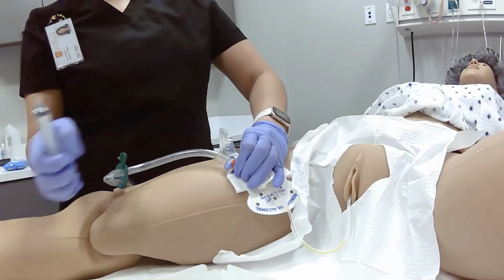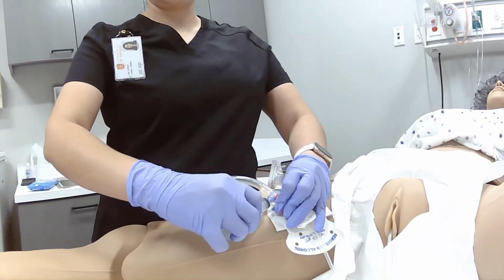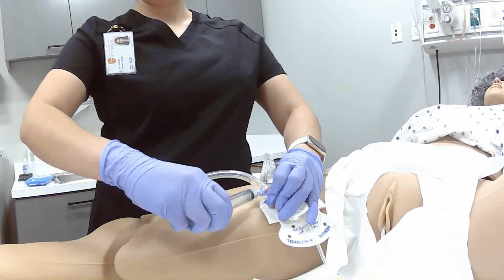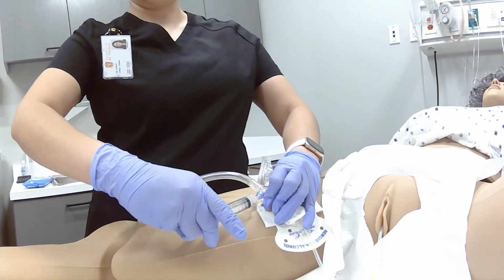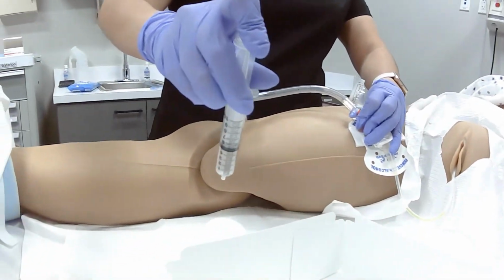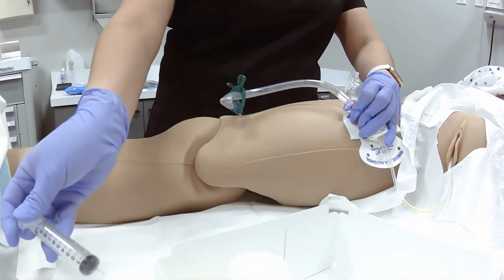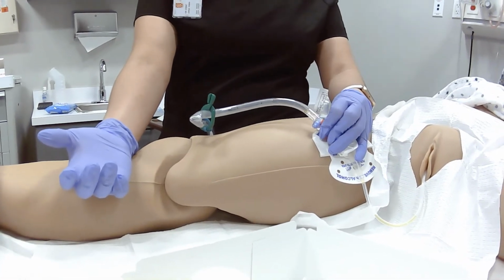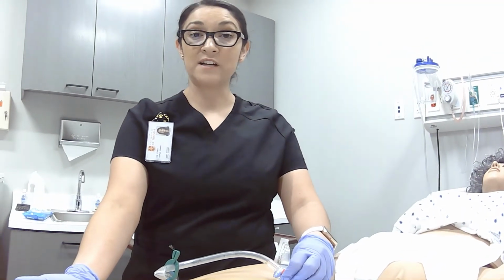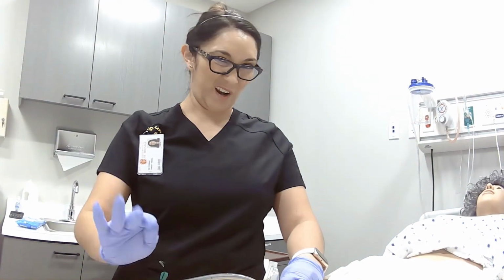Okay? So once that's clean, you'll get your 10 cc Luer lock syringe, and it will go into the port and it'll screw on. And then you'll withdraw the urine from the port. So we'll say this has urine, okay? Once you have your urine, you're going to place it in the cup, making sure that it stays sterile. This would be like if they're doing a urinalysis with culture to test for any bacteria or any pathogens in the urine. So that's why it has to be sterile.